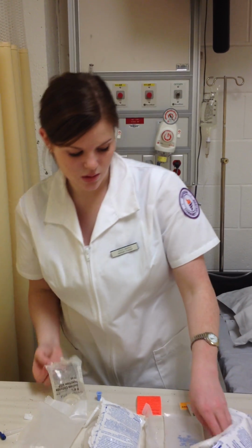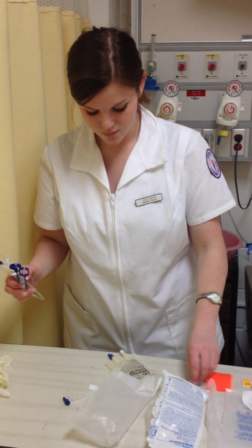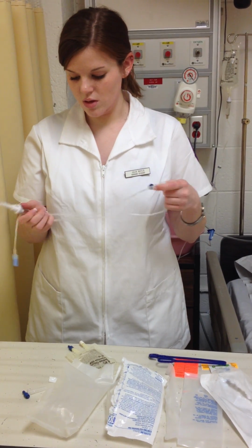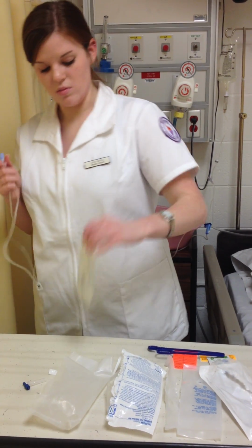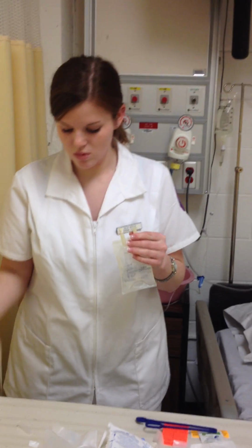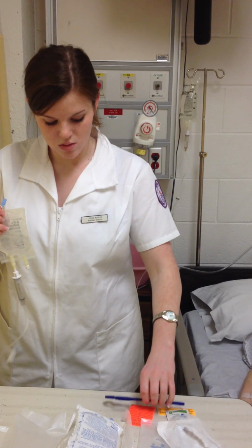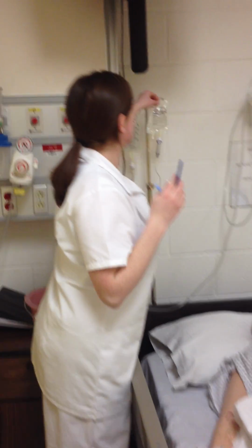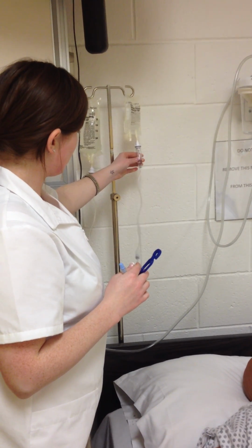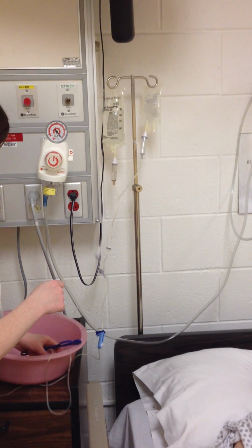And then I'm going to get the secondary tubing ready. I'm going to untangle this, and then I'm going to remove that. Then I'm going to hang the secondary. I'm going to fill the drip chamber halfway. And I'm going to prime the tube. Prime the line.